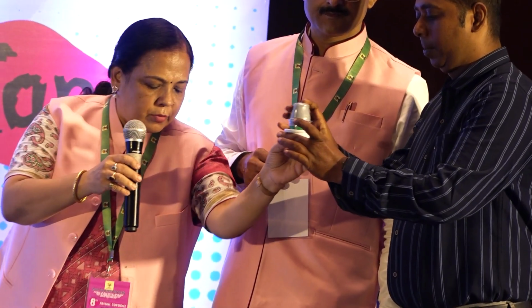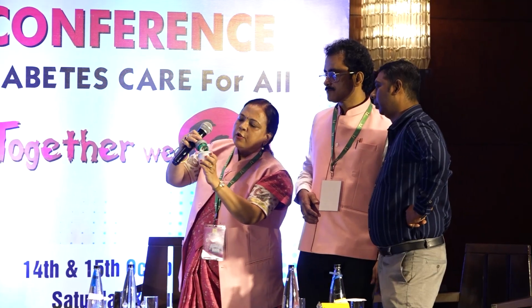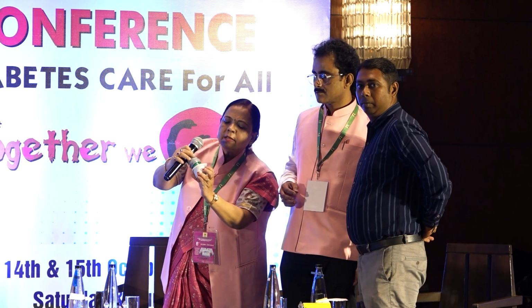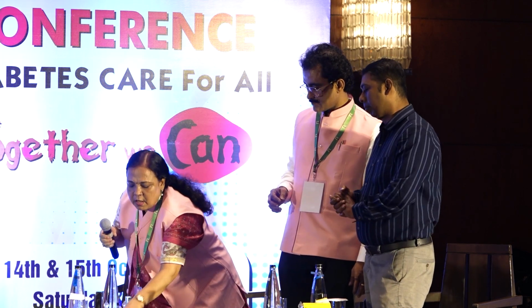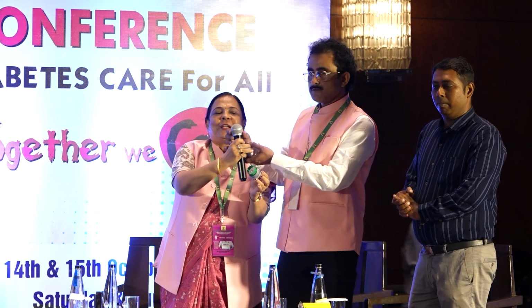Just, no, don't do it like that, because if you do it in the hand, there is a marker over here and there is a groove over here. You have to fit the groove in the marker. Just simple. There is a marker here in the applicator and there is a groove in the sensor device, and you have to just keep it on the table and press it. Once you press it, the sensor comes here. This is the applicator. It has a spring so that we can put it on the hand. So any of you interested in doing can put it for 14 days.